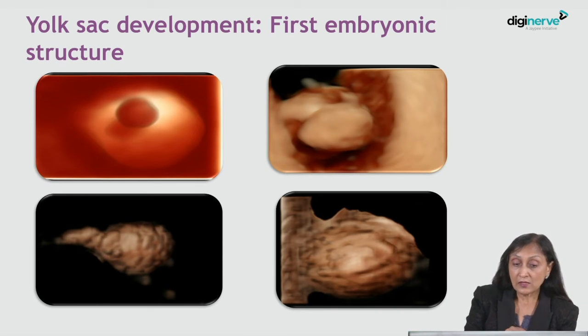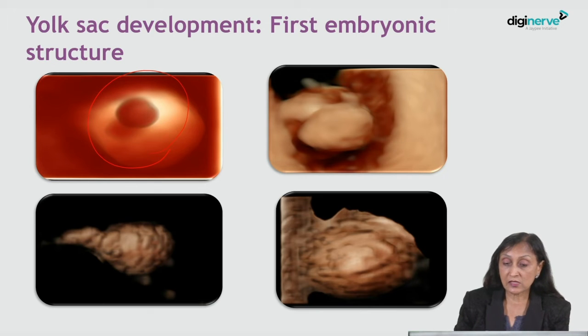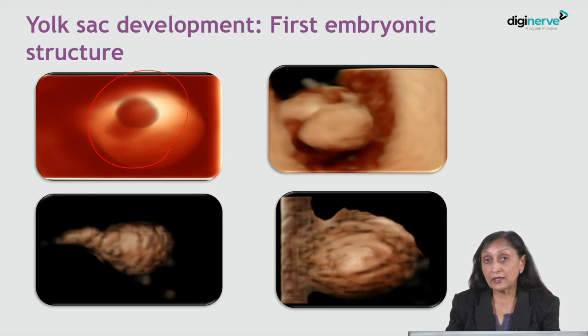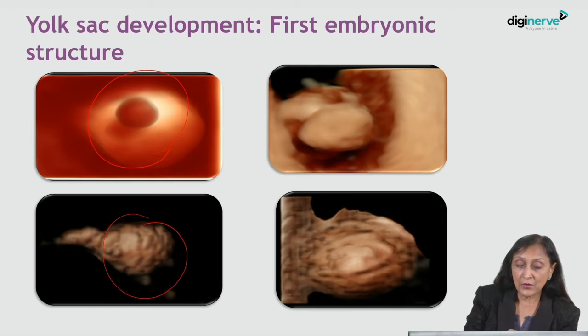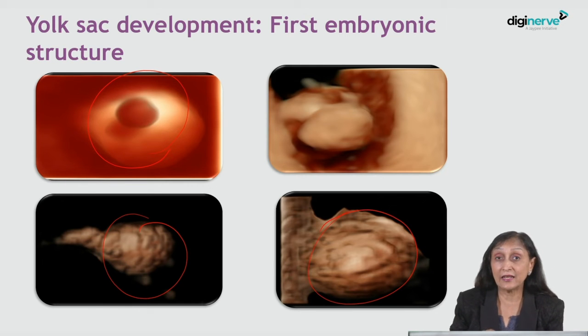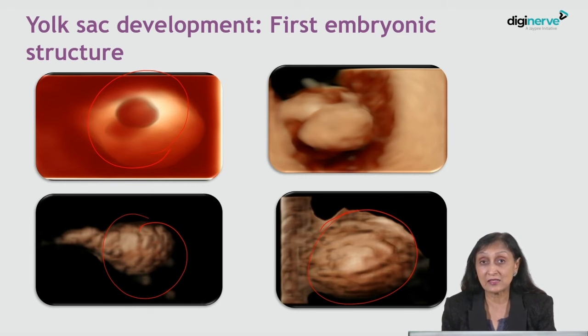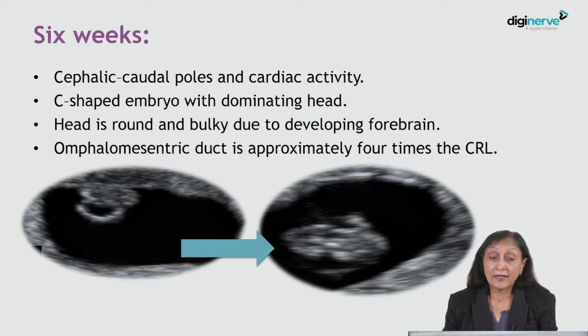At six weeks, the yolk sac appears as a smooth-walled structure. Gradually the surface starts folding and it gives a typical honeycomb appearance in later pregnancy, around 8 to 10 weeks. Absence of a yolk sac is a sign of a blighted ovum.